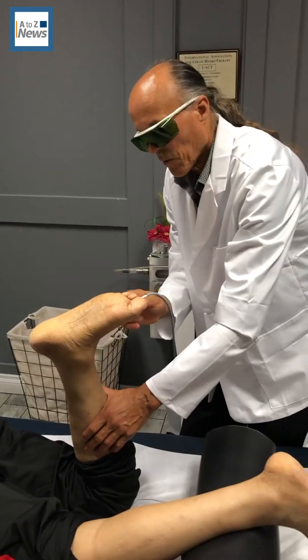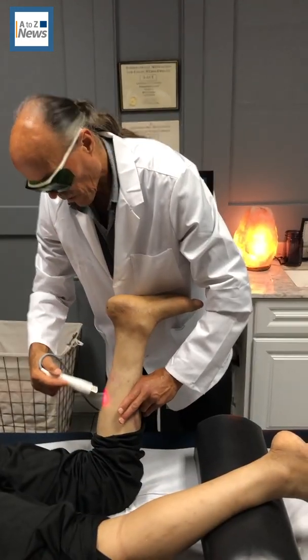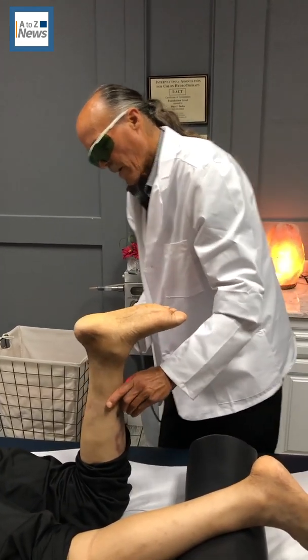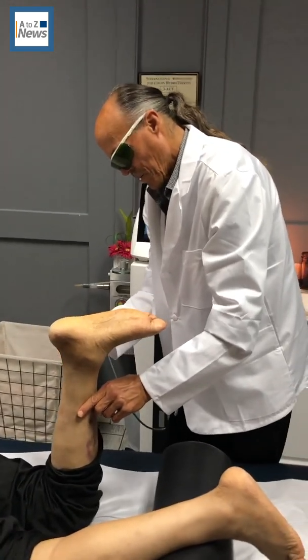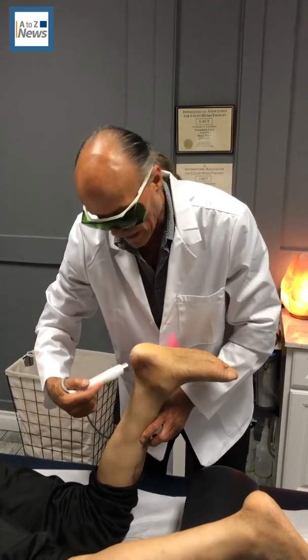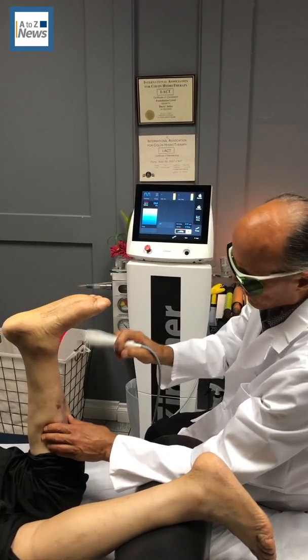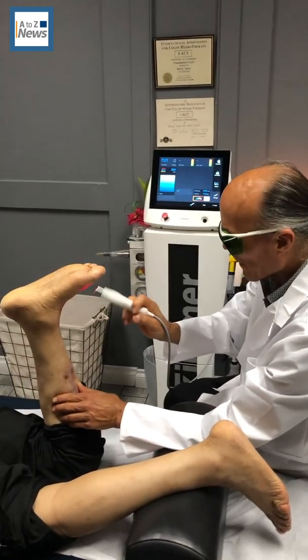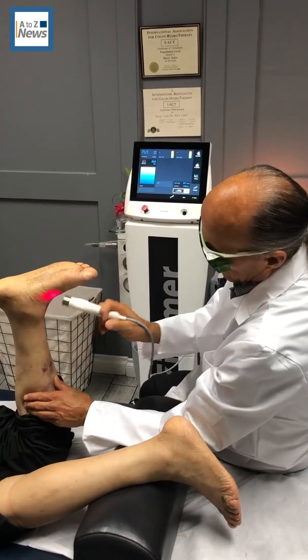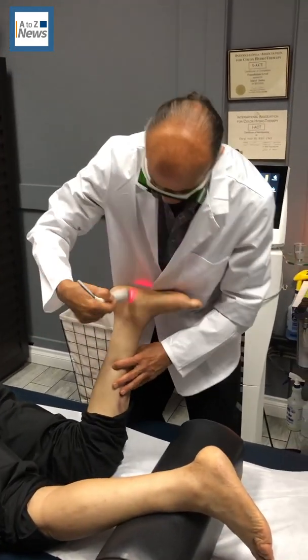This patient has osteoarthritis and the orthopedic doctors want to fuse his ankle. We're getting all the way around the ankle joint and up into the calf muscle to loosen it up, because when you have joint issues the muscles distally will be involved causing referred pain. We're also addressing the degeneration and osteoarthritis in the ankle joint itself, getting all areas of his lower extremity to help his body heal, get more energy down there, activate the cells so they can return back to a normal healing state.